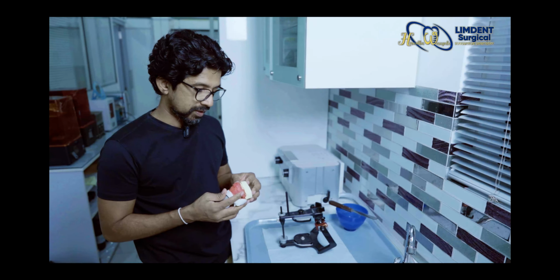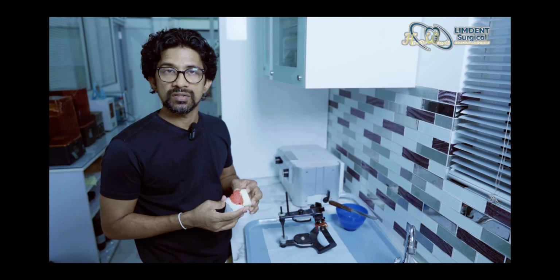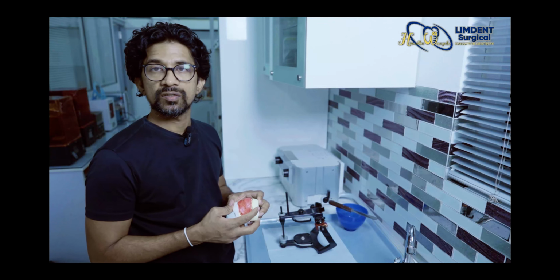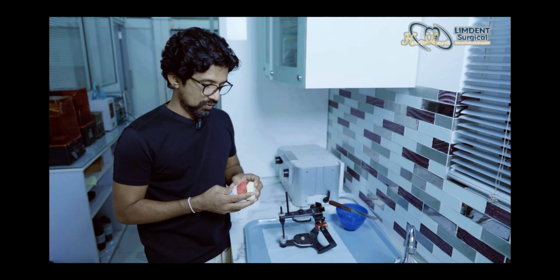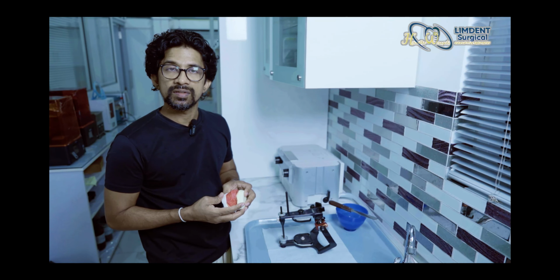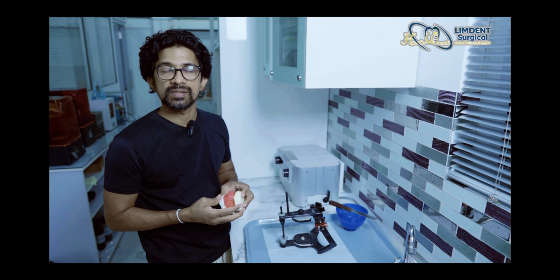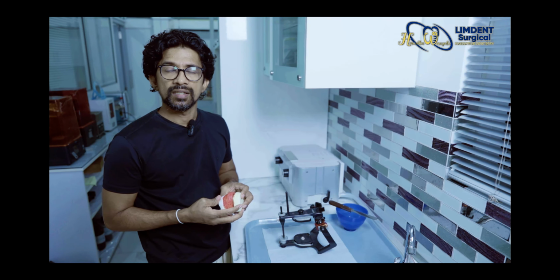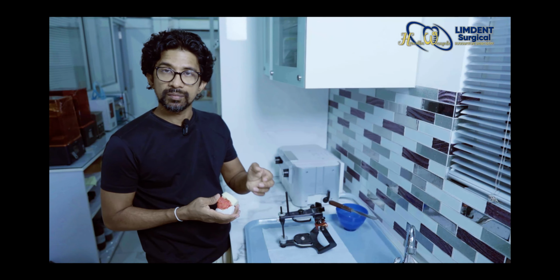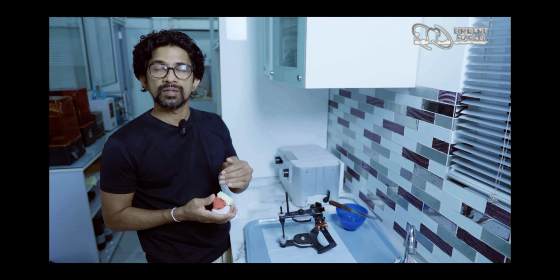So in that case, I want to make sure that the patient's vertical dimensions and what the patient needs with the aesthetics, the labial fullness and the comfort, everything has to be considered when I was recording the patient's bite registration. We can go ahead and mount this case on an articulator. As a clinician, we'll have an idea how the patient's teeth will be set and the occlusion will be arranged. Especially there are so many parameters where the implants will be on the ridge and the teeth will be set on that. So it can be done with manual mounting.